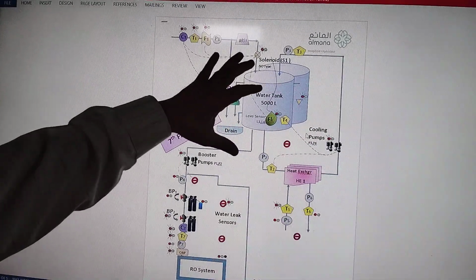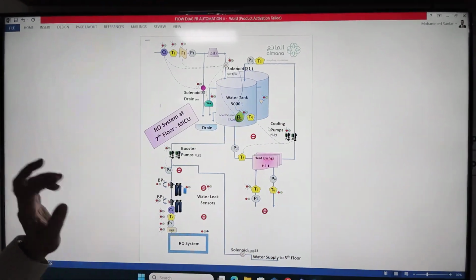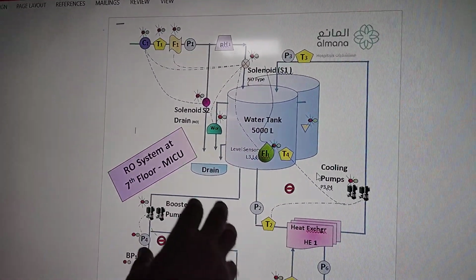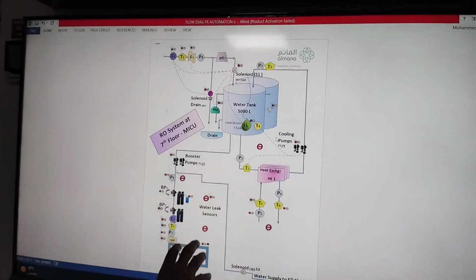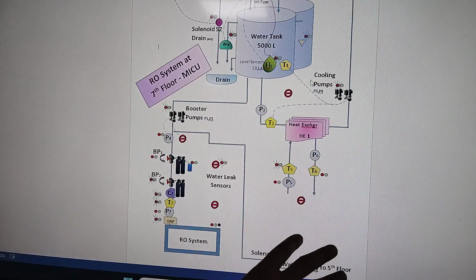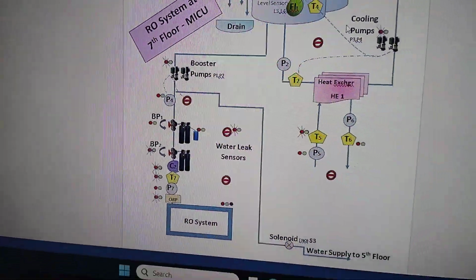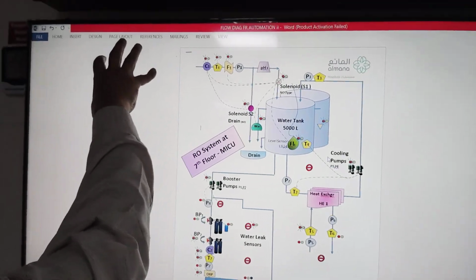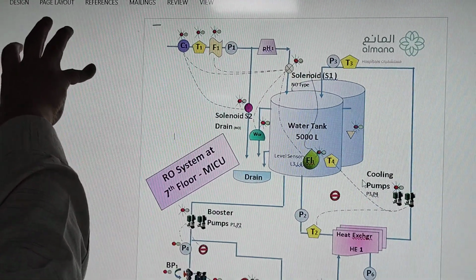So here we have a tank to store the feed water which comes to the RO plant in the dialysis unit, and we have one RO plant in the ICU. So we have three RO plants altogether. One is in the ICU and two in the dialysis unit. So when the water is being stored in the feed water tank, this is being stored by the maintenance department.